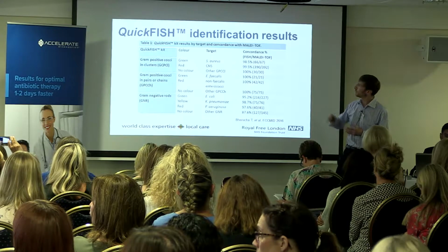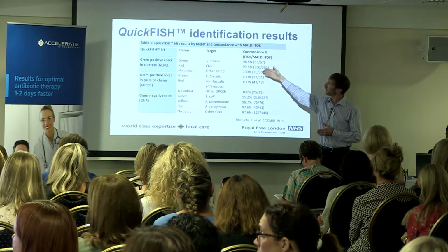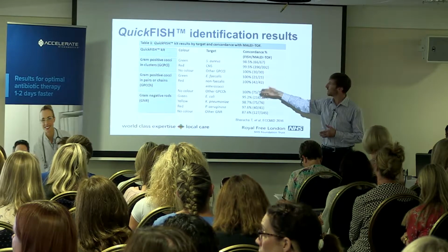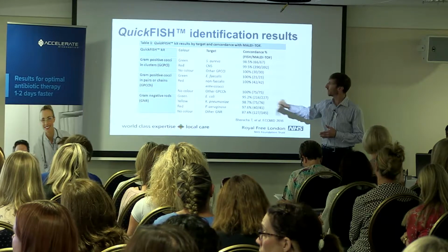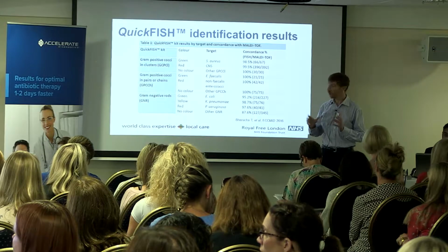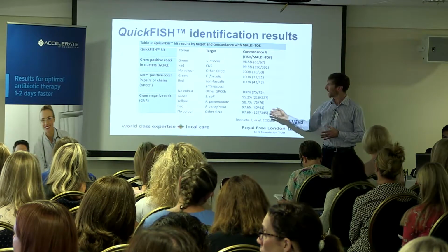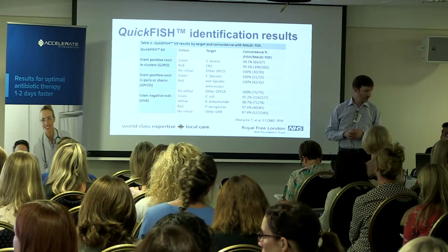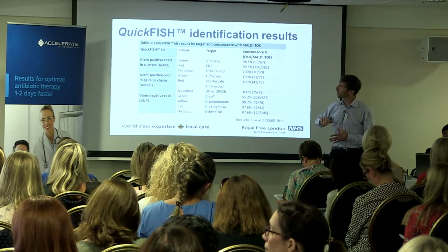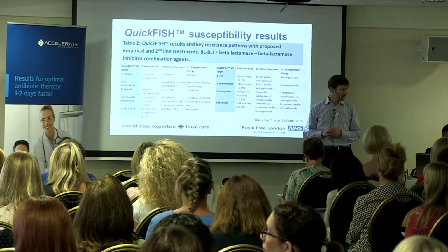So that's how it works, and it performs very well for the gram-positives. So Staph aureus, we just missed one, very accurate for the coagulase-negative staphylococci, perfect for the enterococcal species and the other streps, and quite good for E. coli, Klebsiella, and Pseudomonas, missing 1 or 2 cases over these few hundred cases here, and usually the ones with no color were correct as well, but not always. So very good performance for gram-positives, slightly less good for gram-negatives, which we'll expand upon.